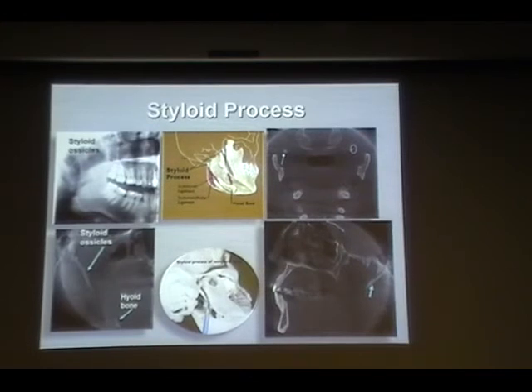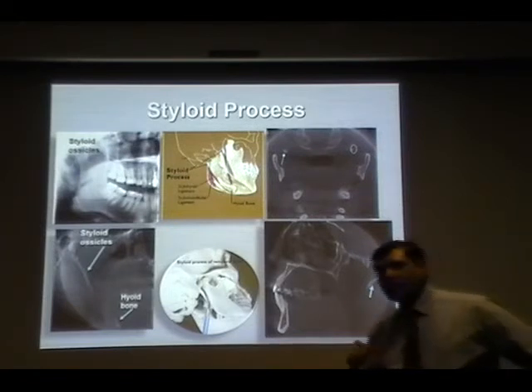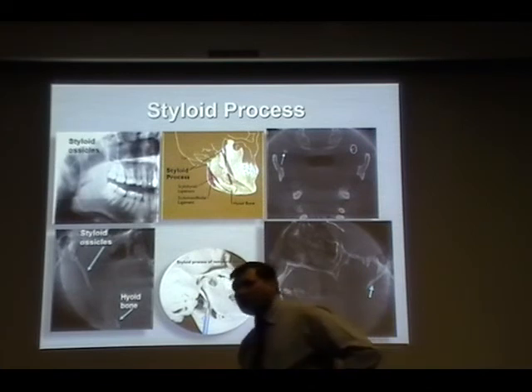Styloid process. Occasionally you can see a ligament getting calcified from the styloid process to the hyoid bone, also called the stylohyoid ligament. Remember this stylohyoid ligament. Most clinicians prefer to use the term Eagle syndrome. That's a misnomer. I wanted to take a second to clarify that.